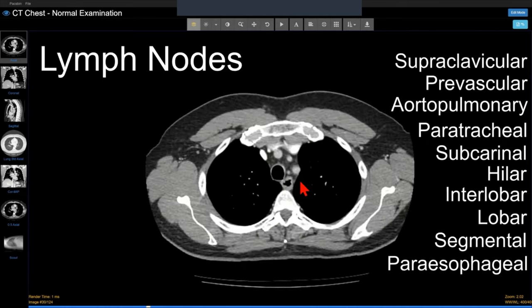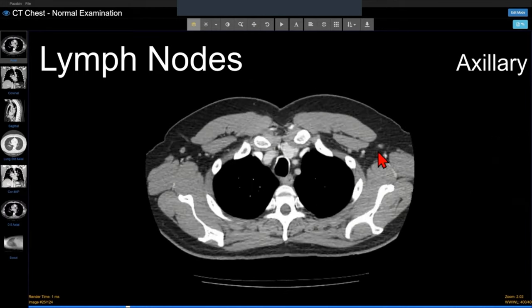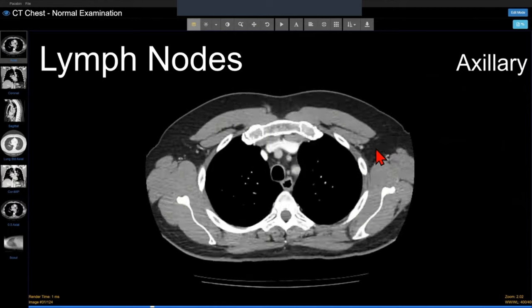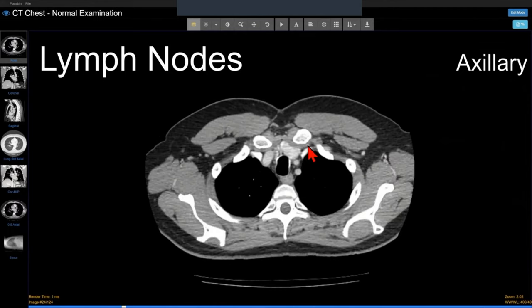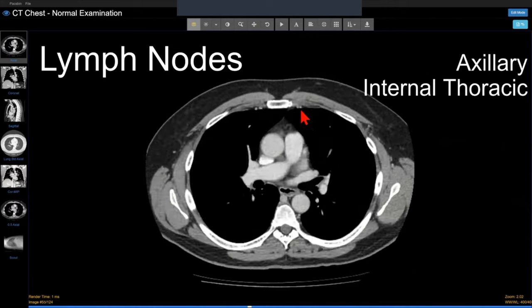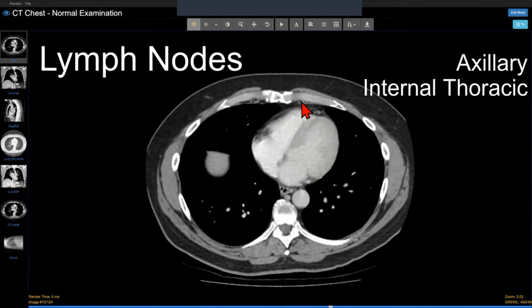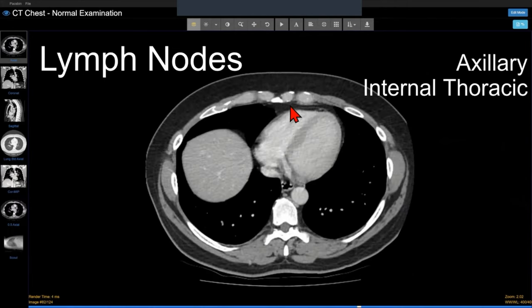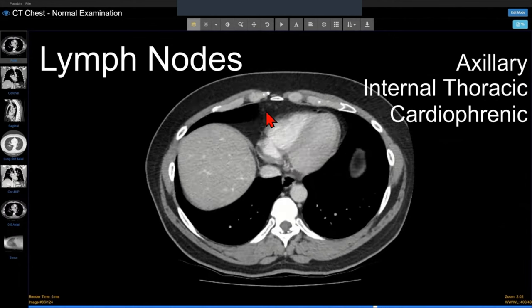Other important lymph nodes in the chest include axillary nodes bilaterally, internal thoracic nodes along the internal thoracic chain, and cardiophrenic nodes inferiorly.